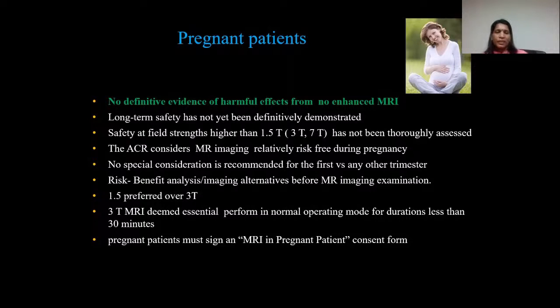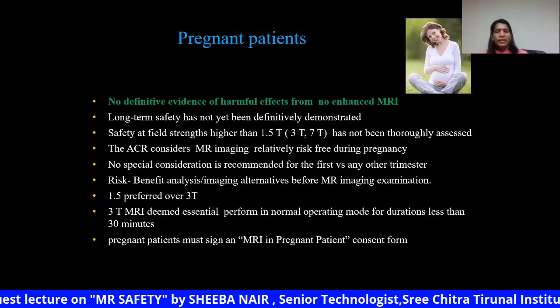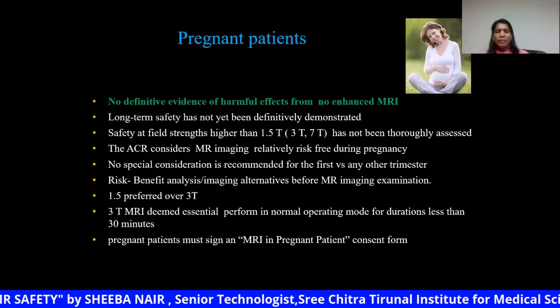There is no adverse effect reported, but we don't know the exact risk associated with doing MRI during pregnancy. So we always do a risk-benefit analysis for a pregnant patient's MRI. If the potential benefit to the mother or the fetus outweighs the expected unknown, unclear risk, then we can do the MRI.